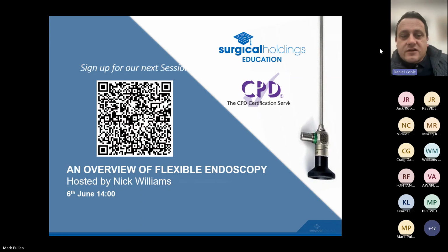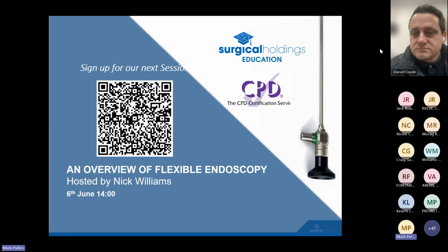So perhaps, Mark, even more so when handling those smaller diameters, we need to be very cautious. Yes, definitely. I think again this just comes with education. I don't think people are really aware of what is inside these scopes; from the outside it looks like a stainless steel instrument, but there are these fine internals. So that's why we're having a big push on the education side of things.